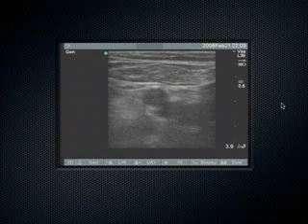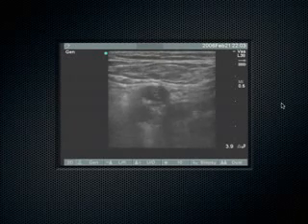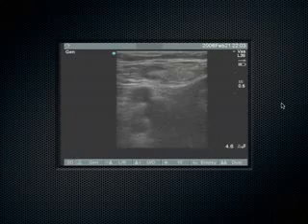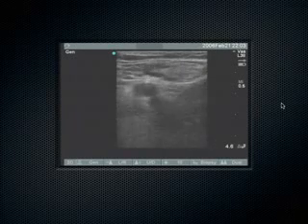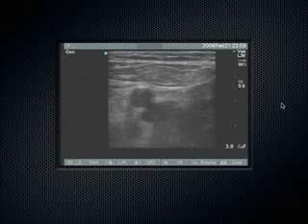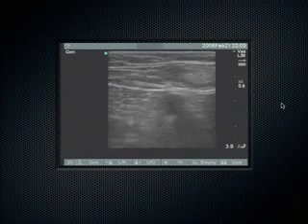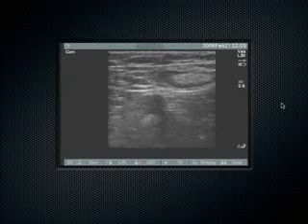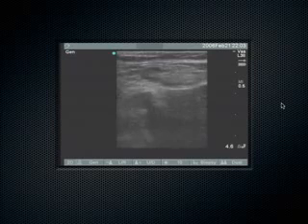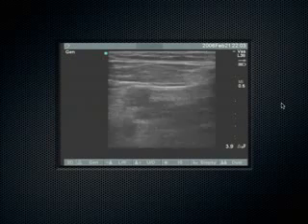But you know what? These patients come in many times who are struggling clinically, they've got this red kind of swollen leg, and you're like, yeah, I don't know. Is there an infection here? Is this cellulitis? Or is there a blood clot here? And so this is one way to kind of help differentiate that. You look for a DVT, and it's easily compressible. There's no DVT.